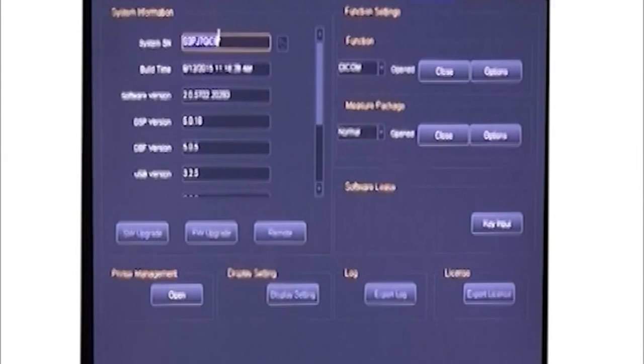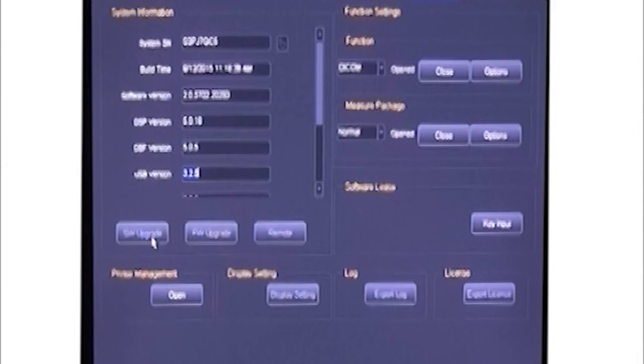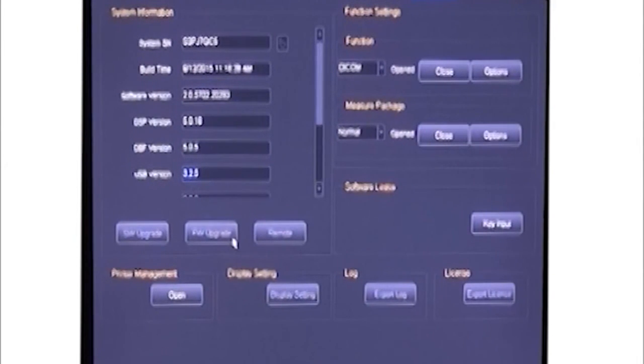Also, it's very convenient to upgrade the system. First, press this key to upgrade software. Then, press this key to upgrade FPGA.